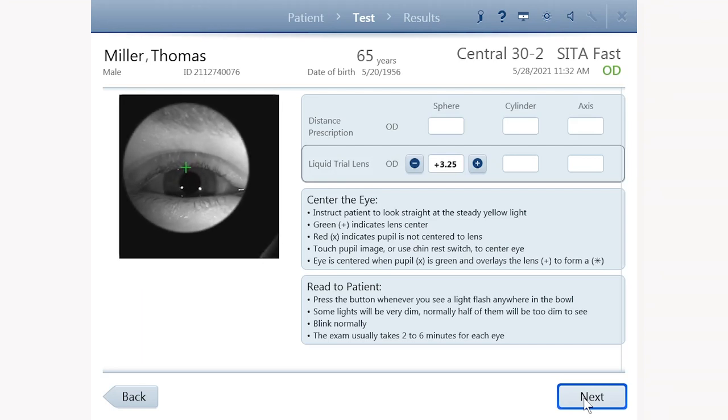The patient's eye is now visible in the camera image on the screen. If you are using gaze tracking, it will automatically adjust the chin rest position to center the eye, so you only need to position the eye within the trial lens. The entire trial lens and patient's eye need to be visible in the camera image.